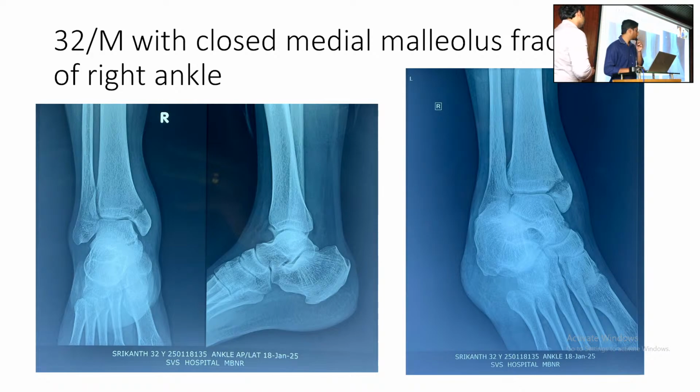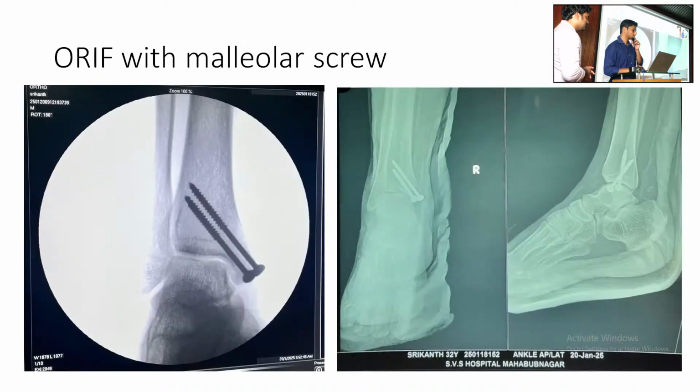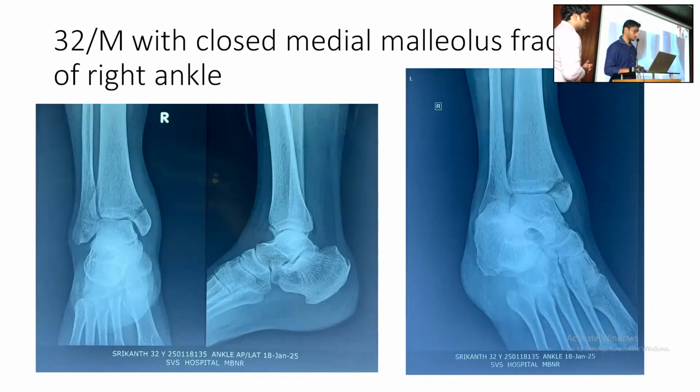That line with the distal tibia is called the incisura. There will be so much detailed radiological description for reading the ankle joint, like the distal radius. If you don't know these minor points, you will miss so many variations.